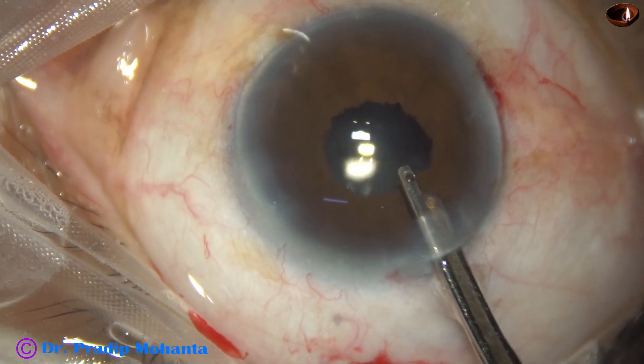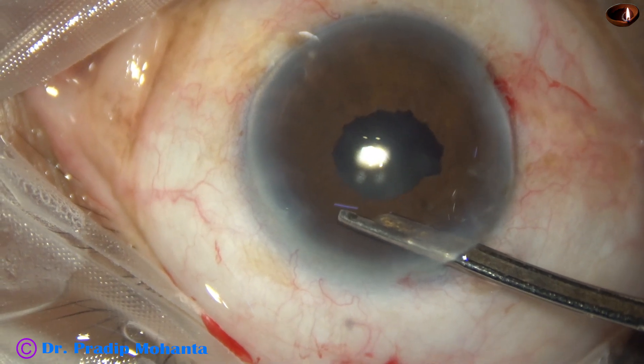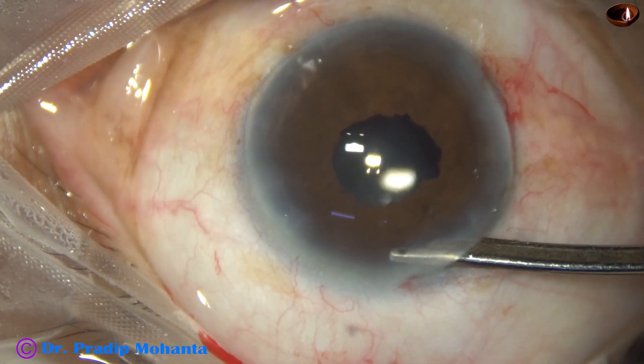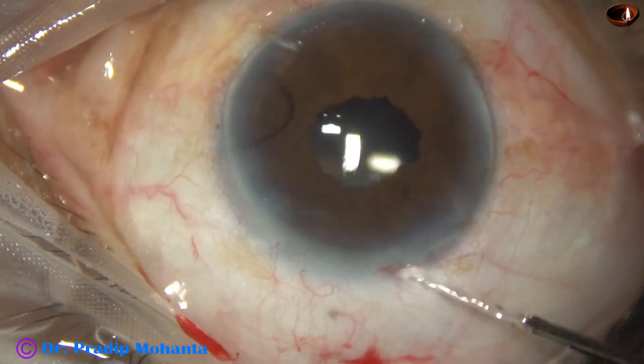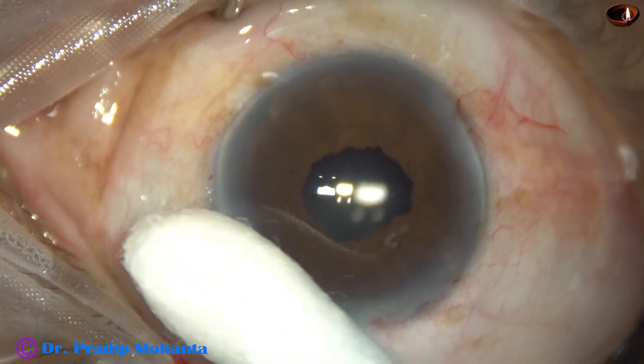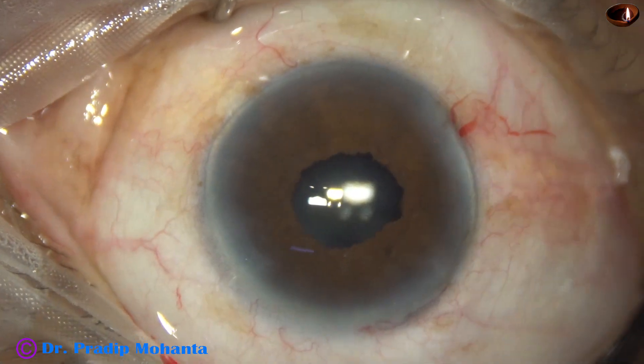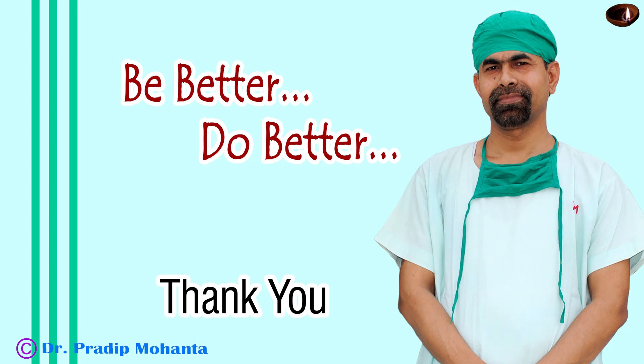The anterior chamber is irrigated and aspirated again. Aspiration is stopped and the Simcoe is placed at the wound. The chamber is nicely formed. A drop of antibiotic is applied over the ocular surface and the case is concluded. Thank you very much for your attention. I hope this video will help you in developing your surgical skills. Be a great surgeon and serve your patients with love, respect, empathy, and great surgical competence.